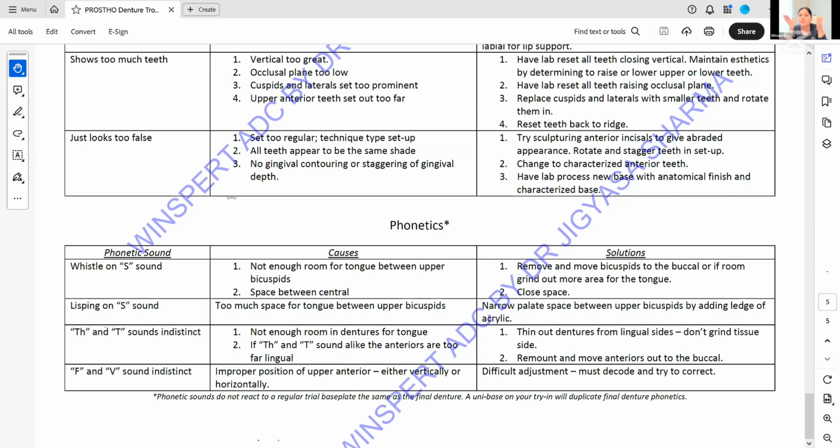When you try to whistle, you narrow your mouth, right? Naturally, when you try to whistle, you have to narrow your arch. So when whistling is happening by speaking, that means the denture teeth arrangement has been narrowed. I hope that makes sense now, Navneet, right? So I hope you had a full visualization of the concepts of this.